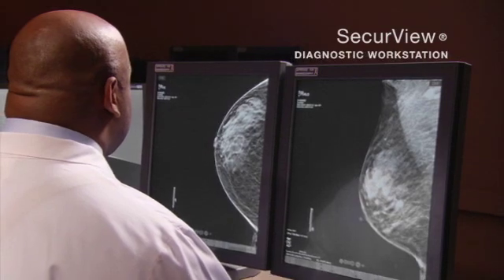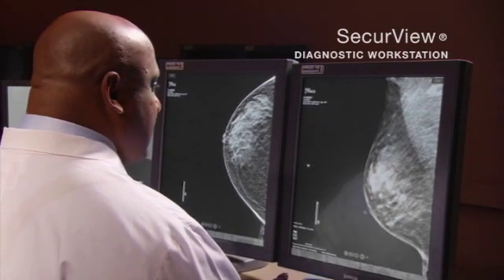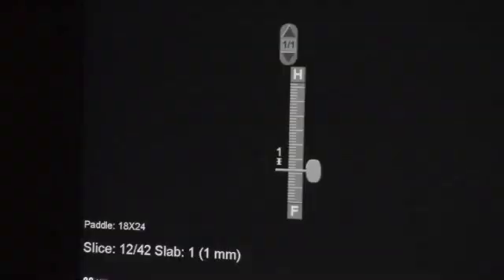The radiologist can examine both 2D and 3D studies with an upgraded SecureView diagnostic workstation.